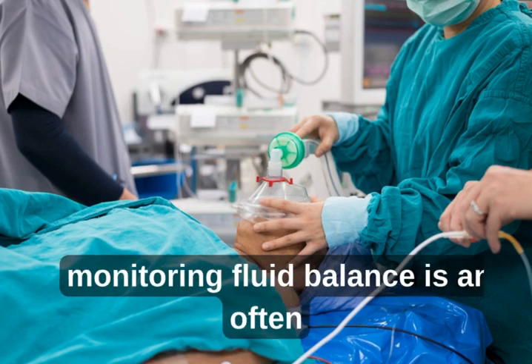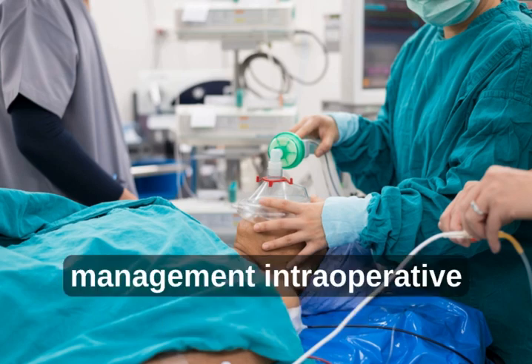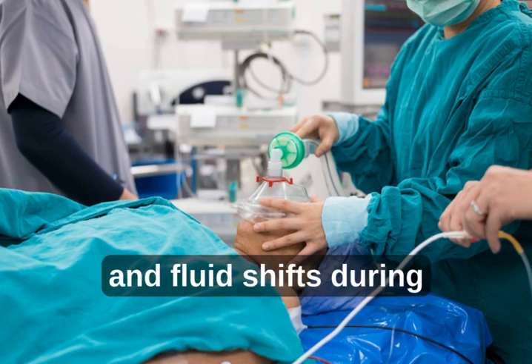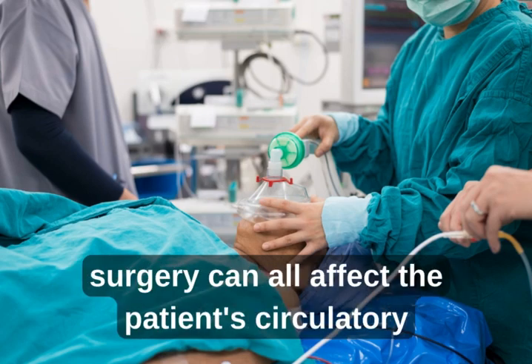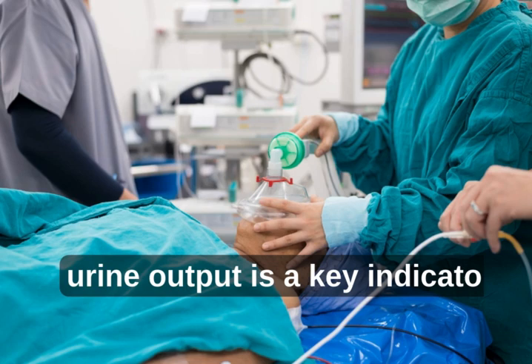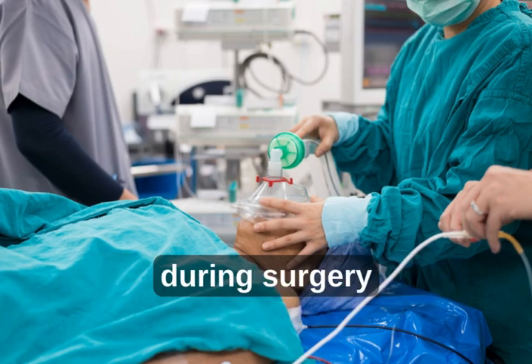5. Fluid and electrolyte monitoring. Fluid balance is an often overlooked but critical aspect of anesthesia management. Intraoperative blood loss, changes in body position, and fluid shifts during surgery can all affect the patient's circulatory volume and electrolyte balance. Urine output is a key indicator of kidney function and overall fluid status.